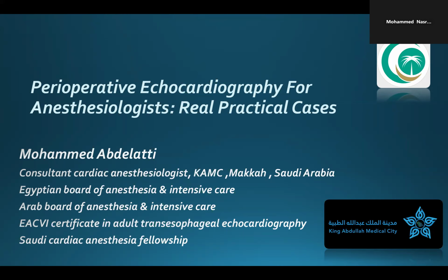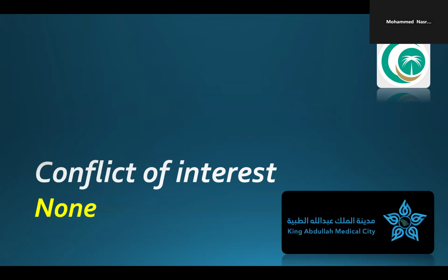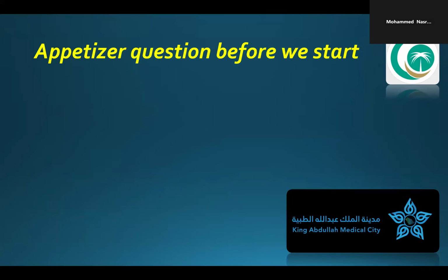Today, I am talking about perioperative echocardiography for anesthesiologists, real practical cases. I work in King Abdullah Medical City, Mecca, Saudi Arabia. I don't have any conflict of interest regarding any of the devices mentioned in that lecture.